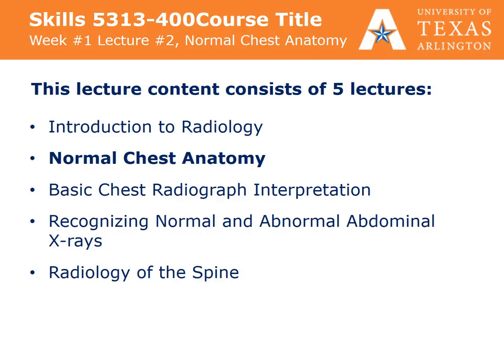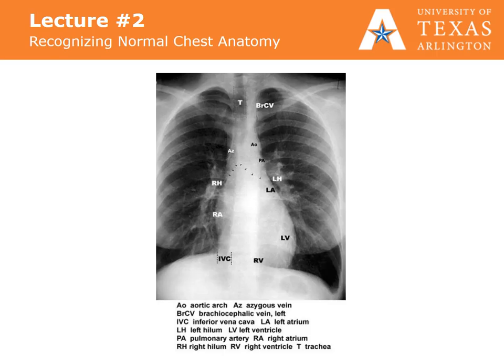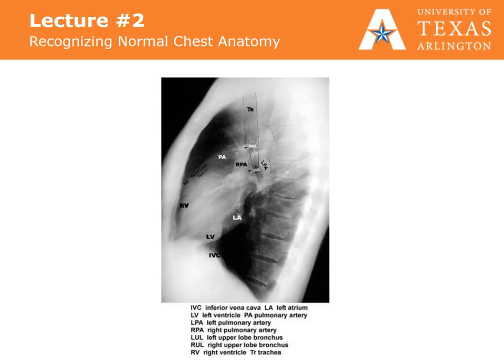This is the second of our five lectures on radiology. This lecture is Normal Chest Anatomy. Here is an image of a normal chest anatomy with labels on it as to the arteries and sections of the heart. Please take note of all of these. This is a lateral chest x-ray with similar labels on it.